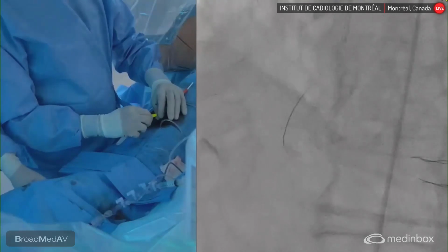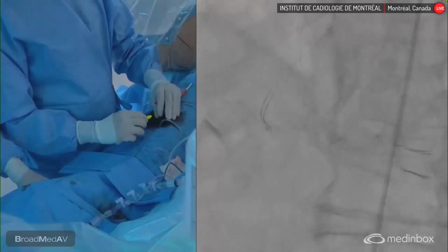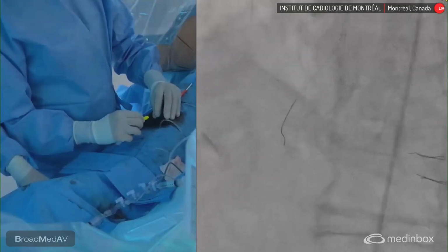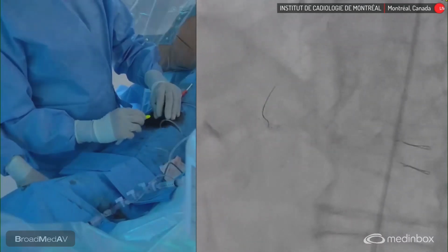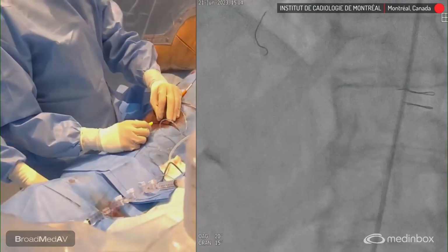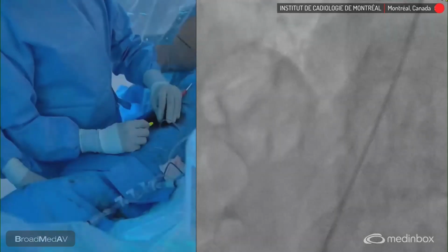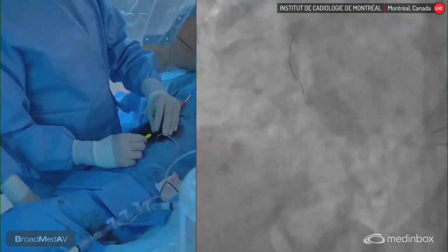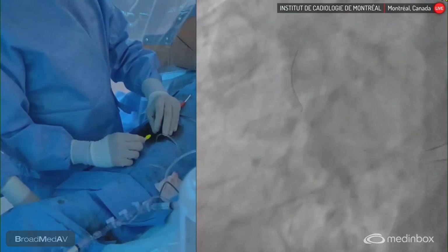So I'm trying to keep my tip flexible to get until the distal. Normally go through the stent now. You want to make sure you're in the right place. So the branch was pretty tight. Let's change projections because which one did you want? Yeah, let's try that one. Can we have the reference, please, of this view? So the angle here was pretty acute of this side branch.